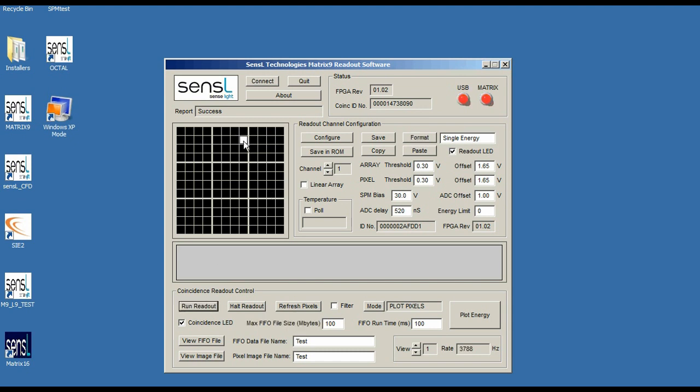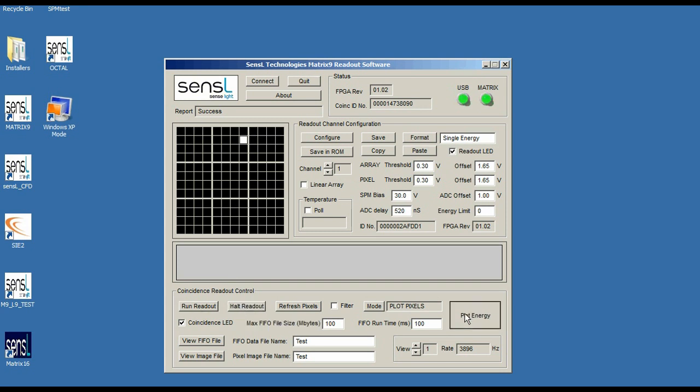Running readout, we can see which pixel we have the crystal over. We can see in this case that we're on array 1 pixel 7. Now I'm going to halt the readout and I'm going to go into the plot energy settings graph.